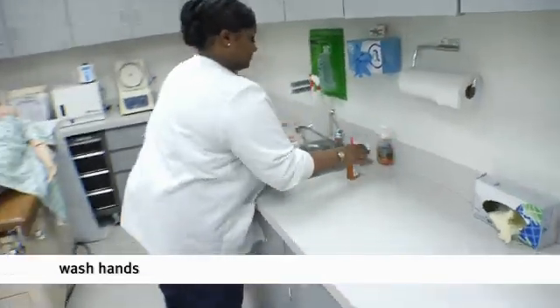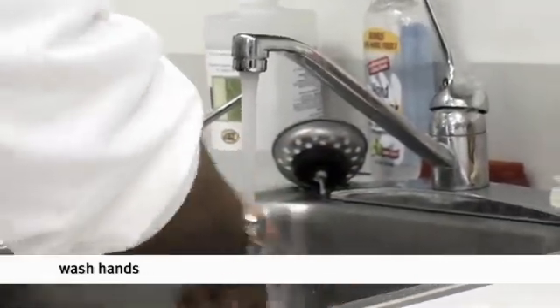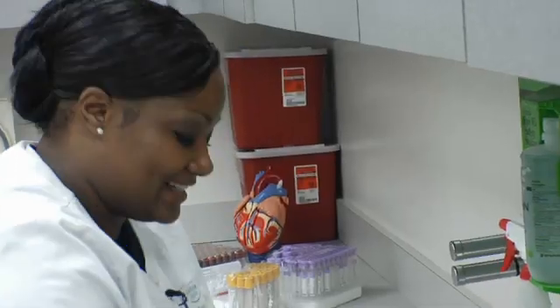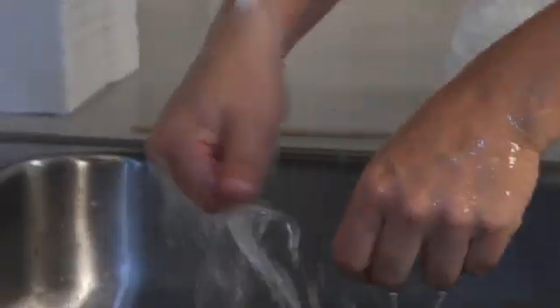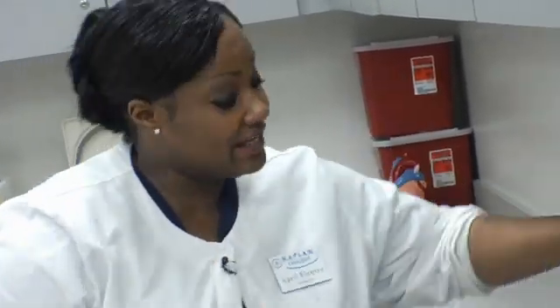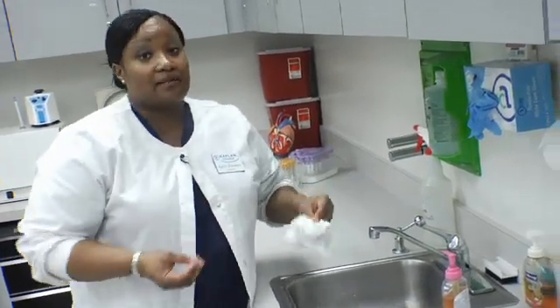Turn on the faucet, grab some soap, and create a nice lather. You want to get rid of all of the unseen microorganisms that you can't see with your naked eye. Make sure that you get thoroughly in between all fingers. Give it a thorough rinse — rinse with the water running down your hands. You can actually stop the spread of disease by a simple hand washing. Turn the faucet off with a paper towel because you don't want to re-contaminate your hands.